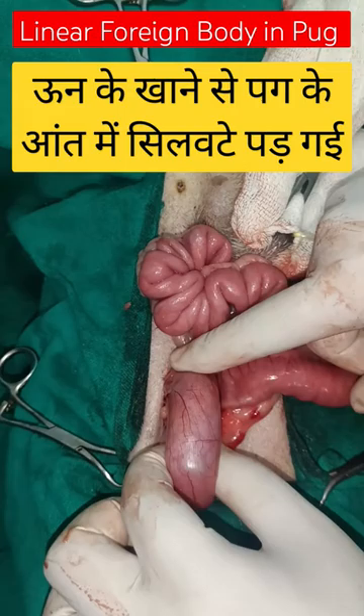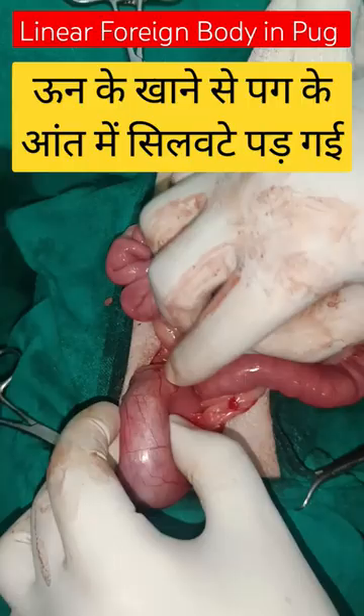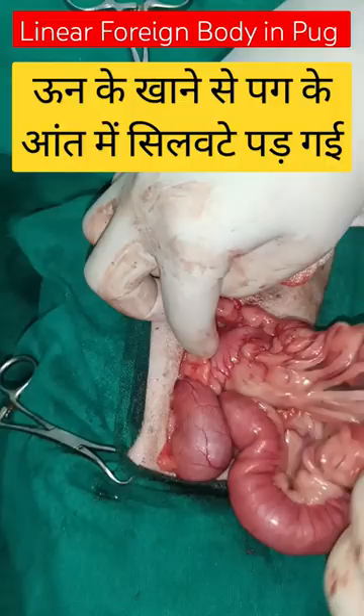You can see the foreign body in the stomach — this is a linear foreign body. It is entangled in the stomach with a thread-like structure, which has gone into the duodenum and from there extended through almost the whole intestine.